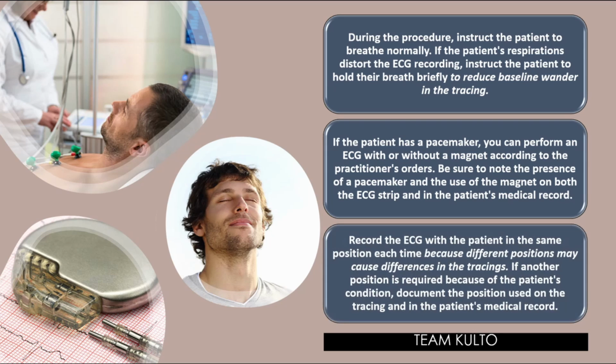Now, record the ECG with the patient in the same position each time because different positions may cause differences in the tracings. So kung supine mo siya kinuha nung umpisa, supine mo siya kukunin all throughout. If another position is required because of the patient's condition, document the position used on the tracing and in the patient's medical record. Pwede naman, pero you just have to note it in your nurse's progress notes.